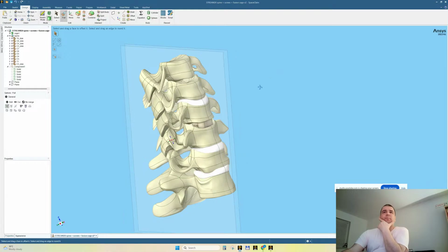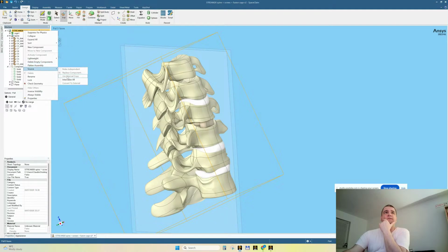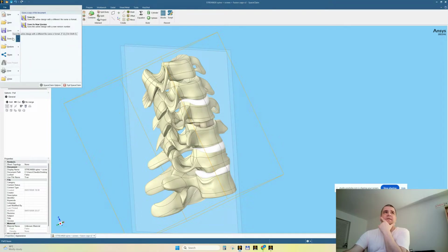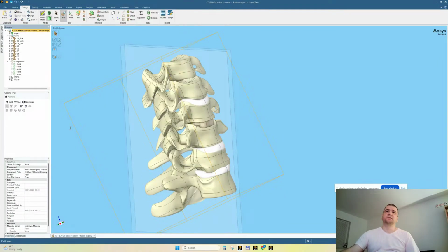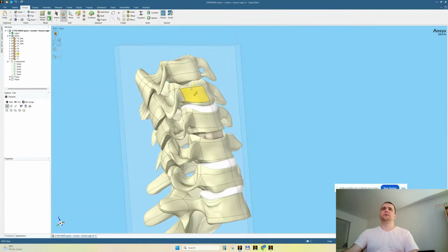There is a very simple command now. Let's hit save. Source internalize all. Delete empty components. Let's hit save, because I'd like to create a third version. This is the most important version. And because we're going to make Boolean operations to combine the parts, the modifications are, let's say, irreversible. This is why you need to create multiple versions in case we mistake something.